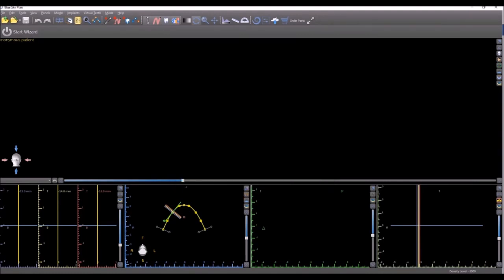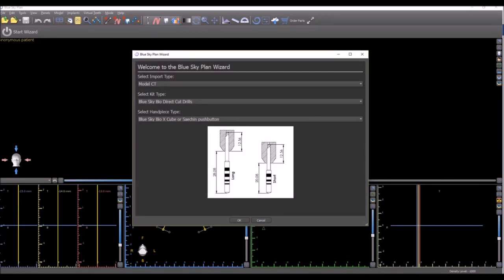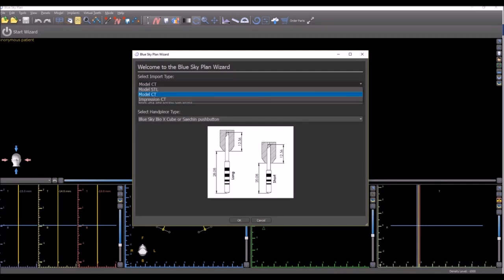The wizard is the fastest and easiest way to treatment plan a case. We're continuing to empower the wizard to be more versatile and allow more users to use the wizard in more situations. As you can see, the welcome screen for the wizard now allows the user to select which type of model or impression they're going to be importing.